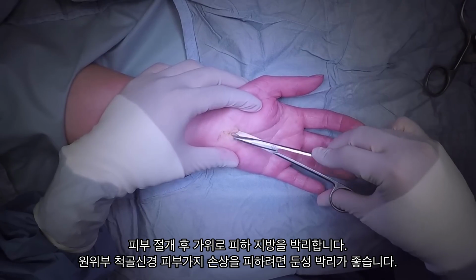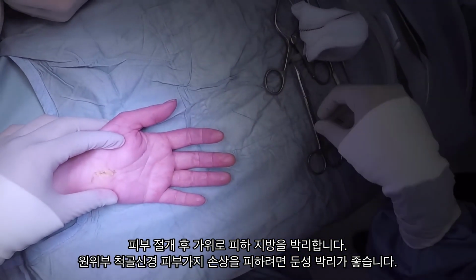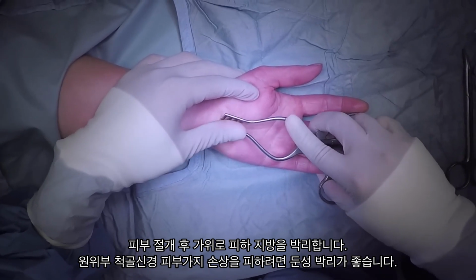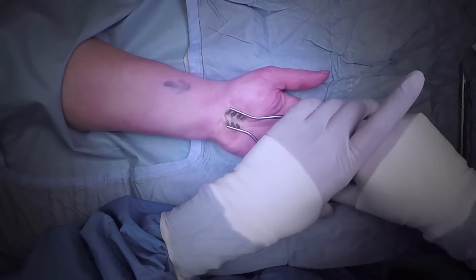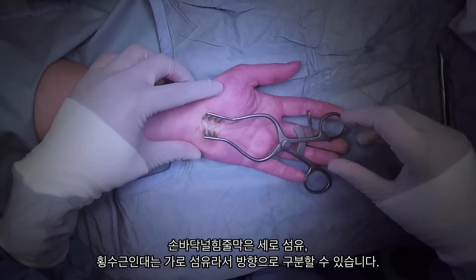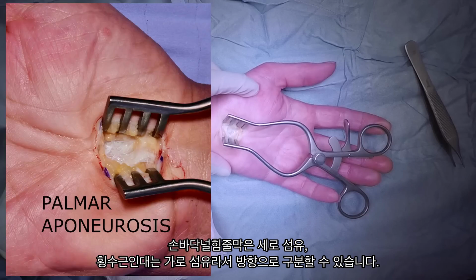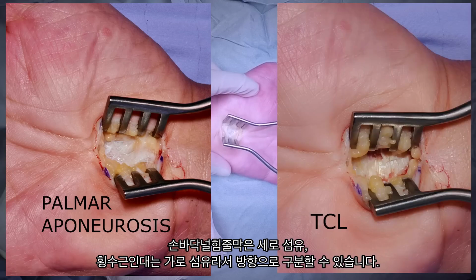One of your best friends for this procedure is your West self-retainer. Inserting it now will help your dissection, and you can now visualize the palmar fascia, a thick fibrous layer of tissue. You can differentiate it from the transverse carpal ligament by the direction of its fibers. The palmar aponeurosis has longitudinal, slightly divergent bands compared to the transverse carpal ligament's transverse bands. If we look at it close up, we can see the longitudinal fibers of the palmar aponeurosis here on the left and compare them to the transverse fibers of the transverse carpal ligament on the right.